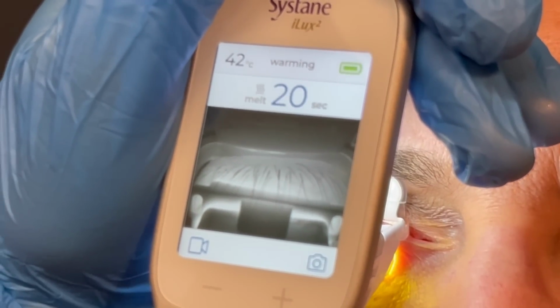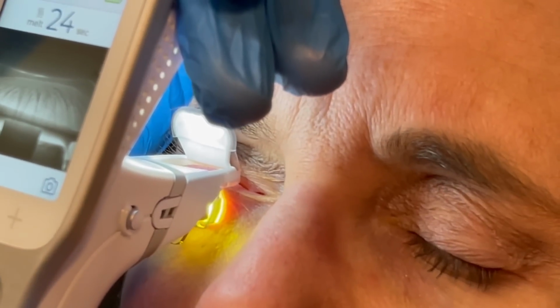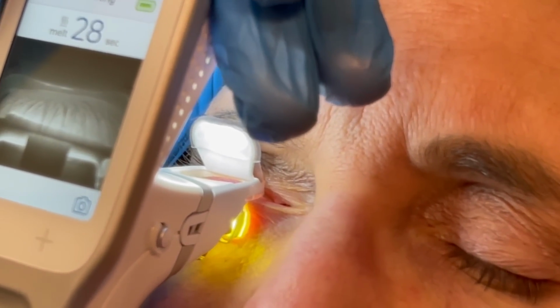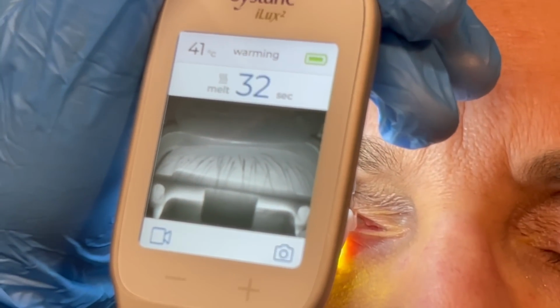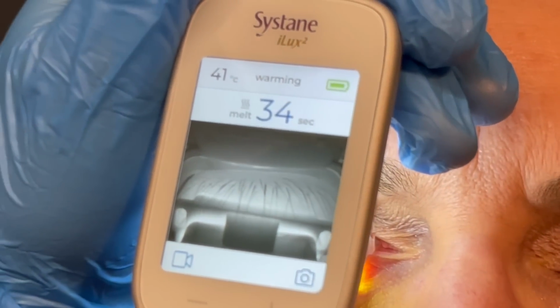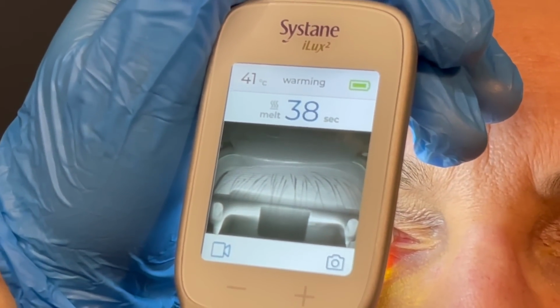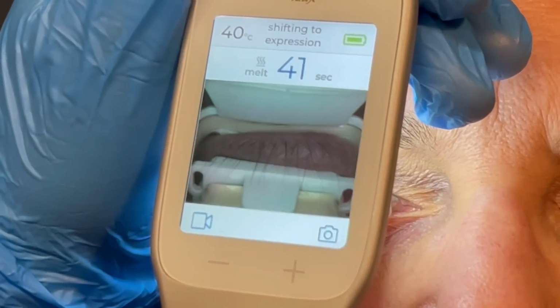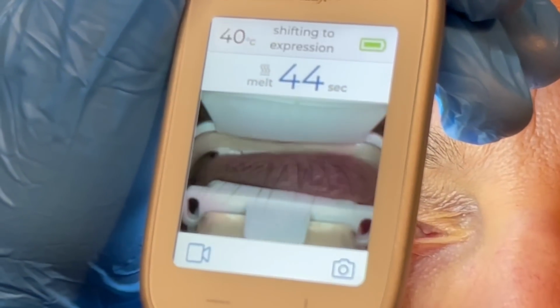You're about 20 seconds in. You're doing great. And about 30 seconds in. And we're now at 40 seconds, so we're going to push all that nice oil to the surface with this little mini massager sequence.